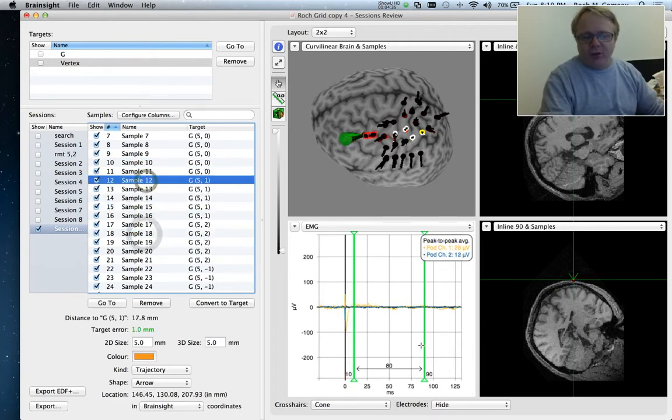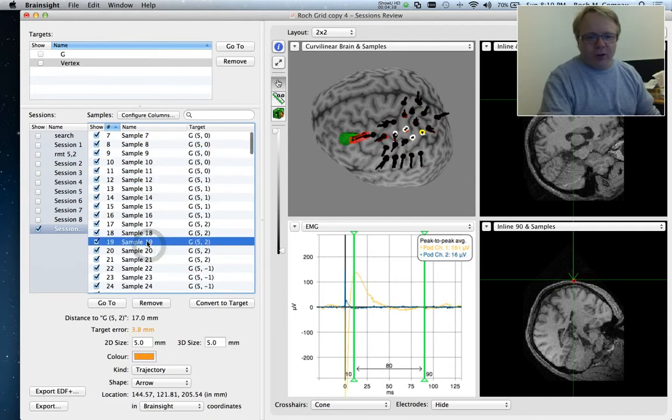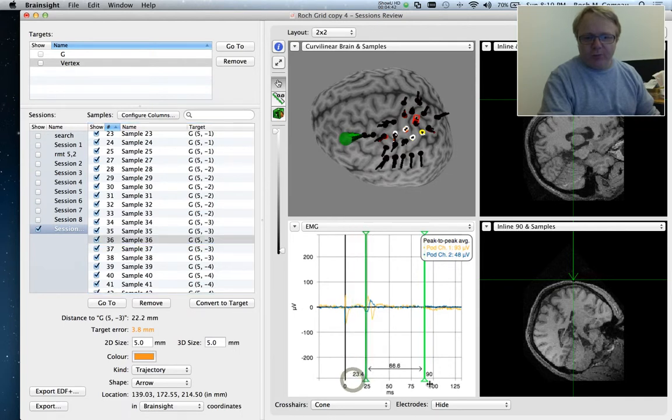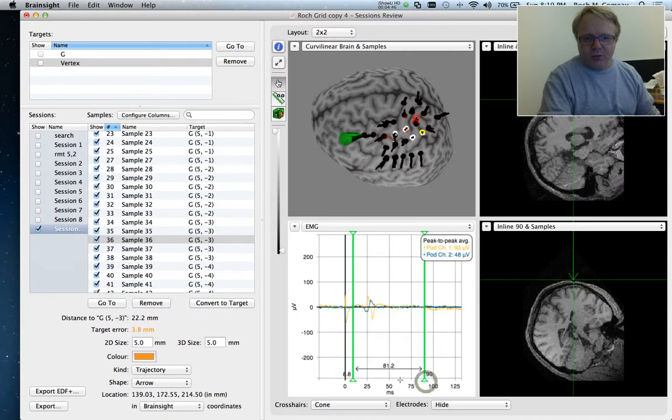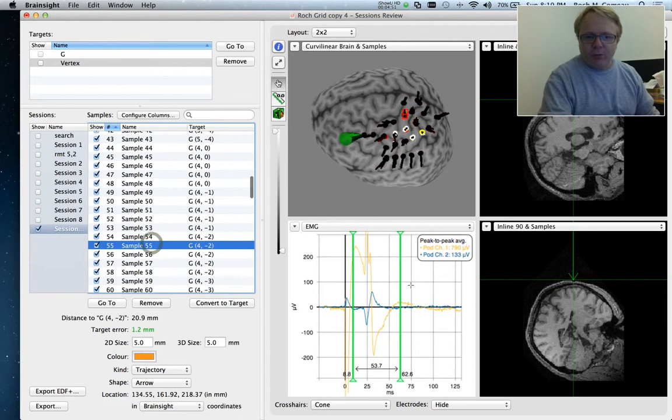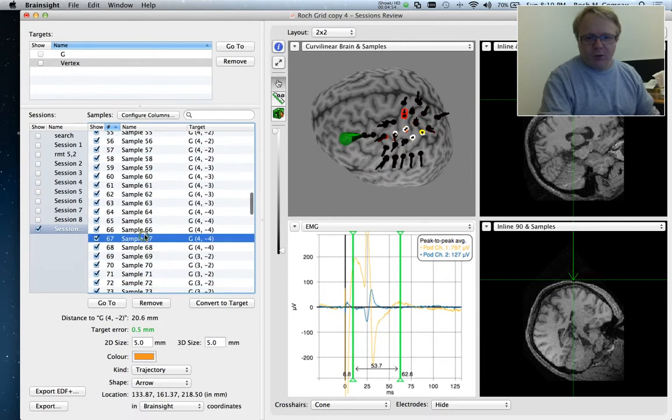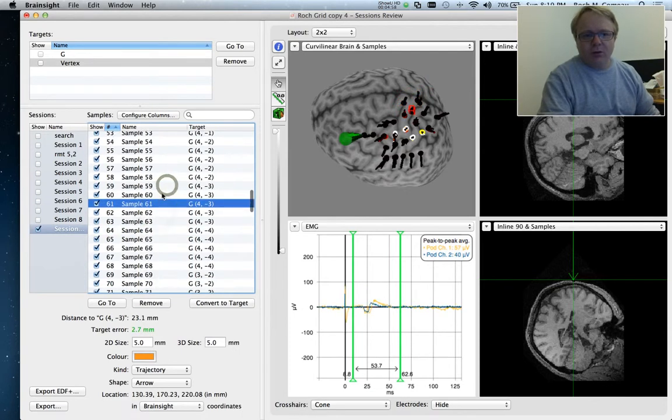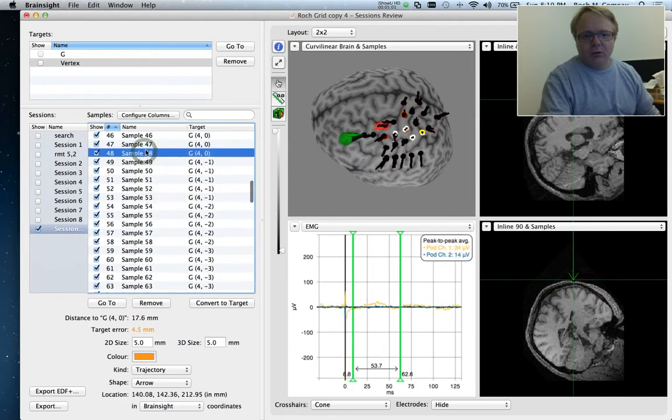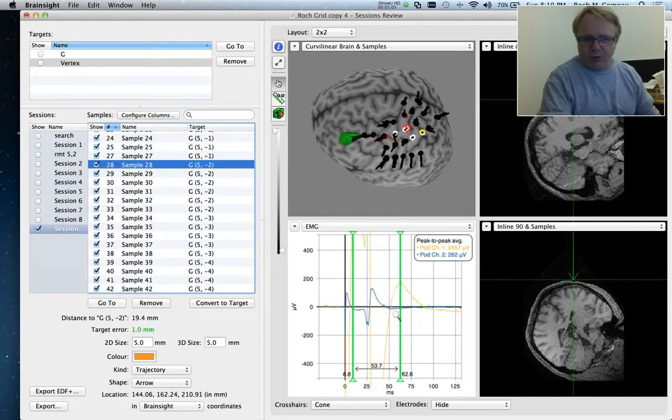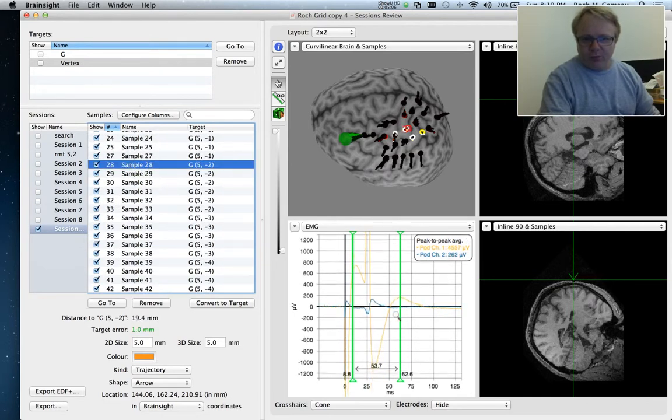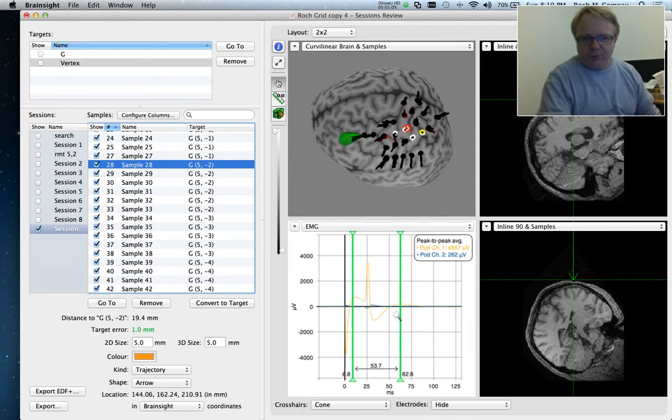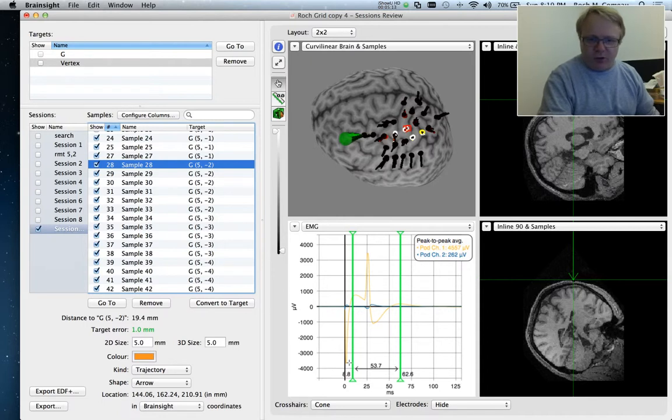So the idea here is that we can make sure that the data makes sense, that we don't have any bad samples. And I can change this window to make sure that the EMG or the MEP values that we're actually looking between reasonable start and finishes. Let me zoom out here. Some of these are quite big pulses. So here's the typical one.